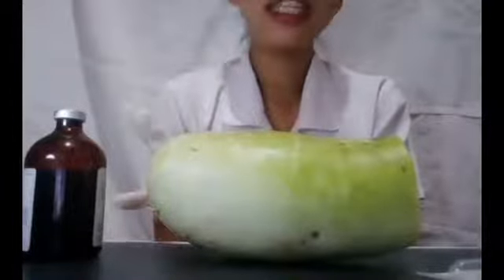So next is for the intramuscular medication. So when drawing medication up from a vial, don't forget to record the lot number and the manufacturer name, and you also want to make sure to check its expiration date. So this is a vial I've used before. It's not really real, it's just for pretend, for demonstration purposes. So let's just pretend it's a vaccine.